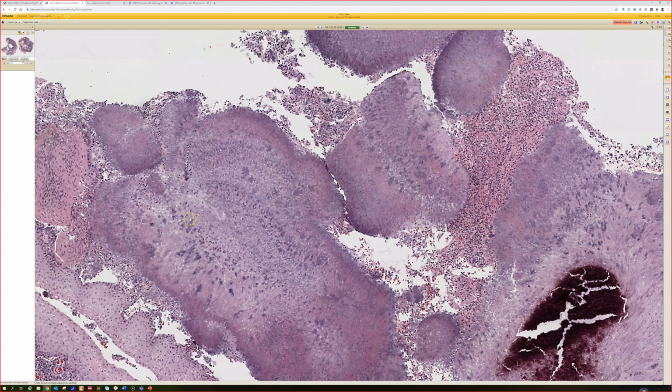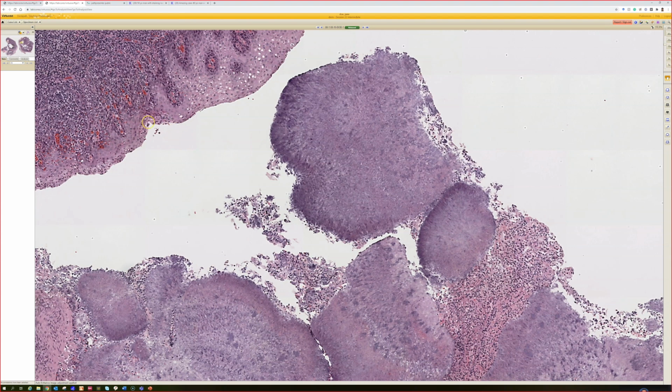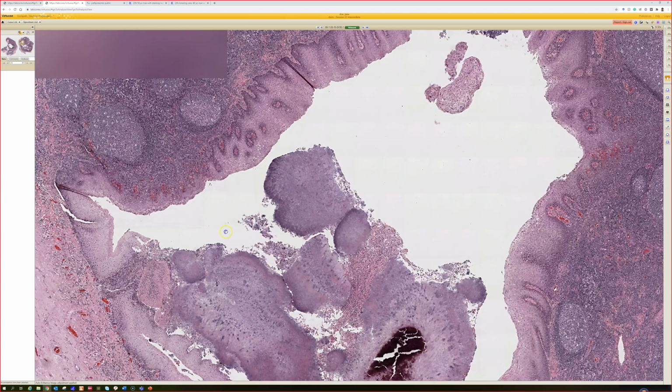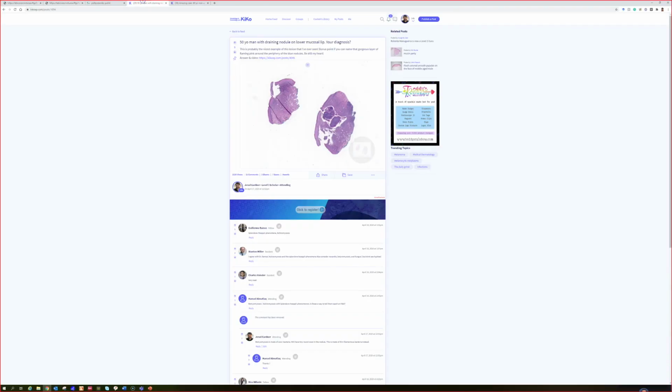Whereas if you see this elsewhere in the body, like in the skin or the subcutis, then that indicates an actual active infection. But this is almost a commensal type situation, I think of. I don't know, maybe someone else will disagree with me. But in the tonsil, we see this a lot. But so what other things can make this sulfur granule type structure?